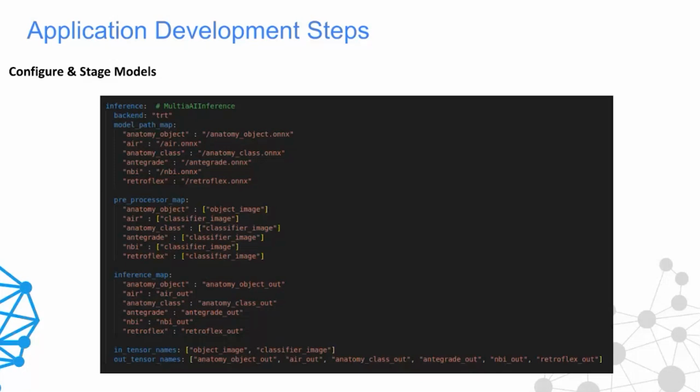Along with this, once the Holoscan application is run, only the first time it is going to load the ONNX and create the TensorRT engine files. From the next time, it is going to use the cached version of the engine files. So you can actually safely delete the ONNX files from the Docker image itself once you have the engine files. This is useful if you are giving your models as part of an edge application where you have little control over security or protection of your models.